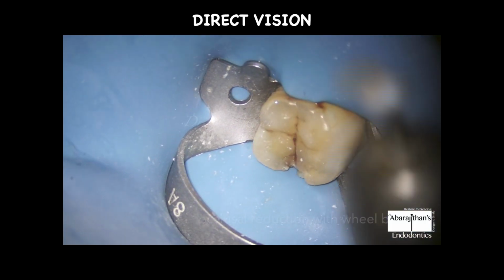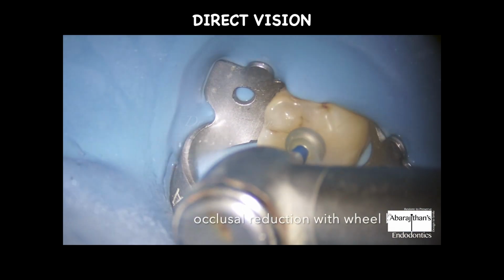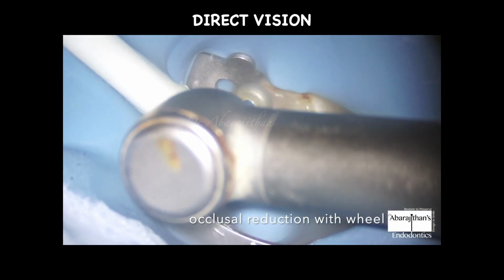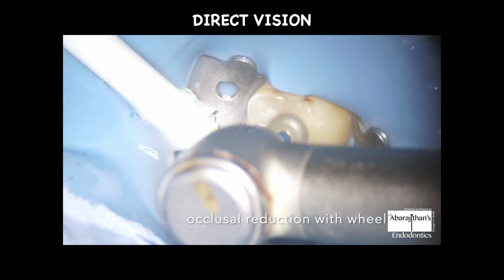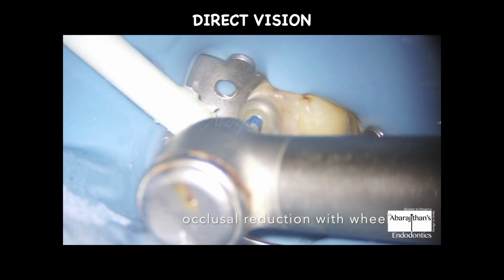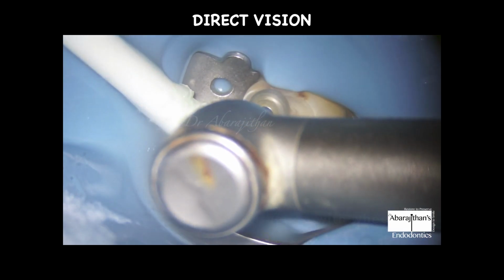So even in posteriors, this is a common myth. People think when we work in posteriors, it's always indirect vision. Not so, not necessarily. This is a mandibular second molar where endo is going to be initiated, and the initial occlusal reduction can be done very much with direct vision.